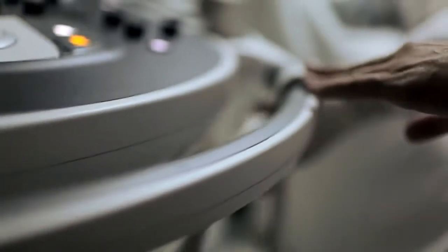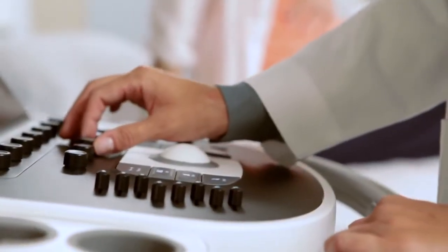EPIQ is almost silent when running, equivalent to the sound of a library. Its small footprint and extreme maneuverability allow it to fit in tight spaces with ease.